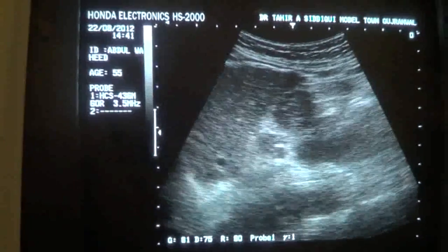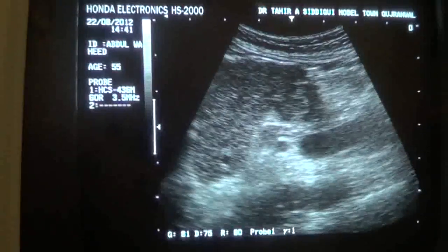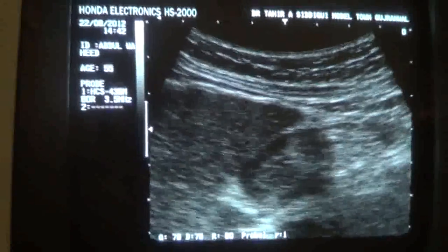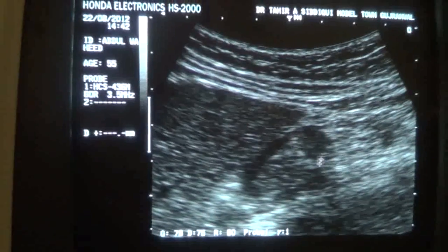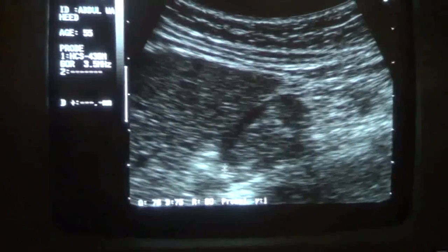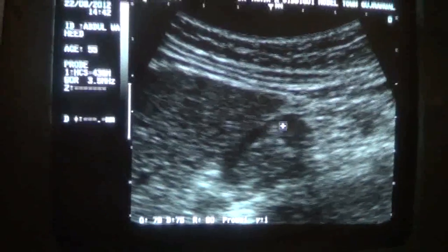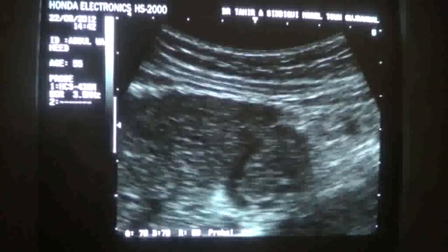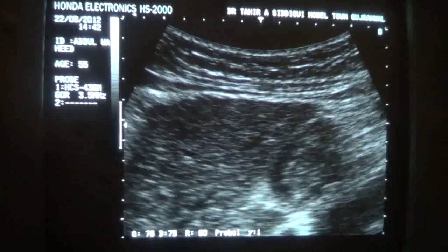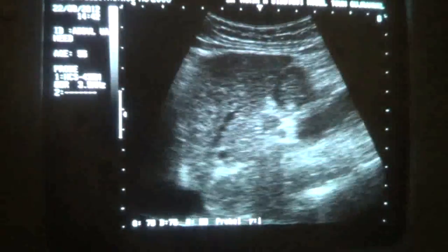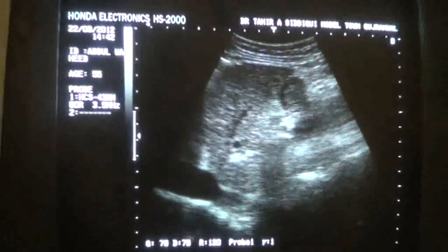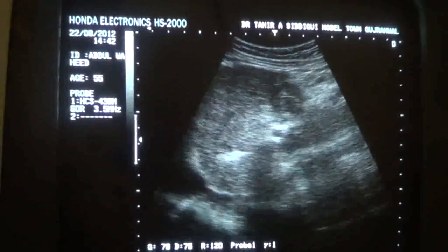This is the typical target sign appearance of a bowel in transverse section. This is a bowel in transverse section. This is the wall of the bowel — the hypoechoic area. And there is no focal lesion seen relating to the left lobe of the liver or the liver angle.